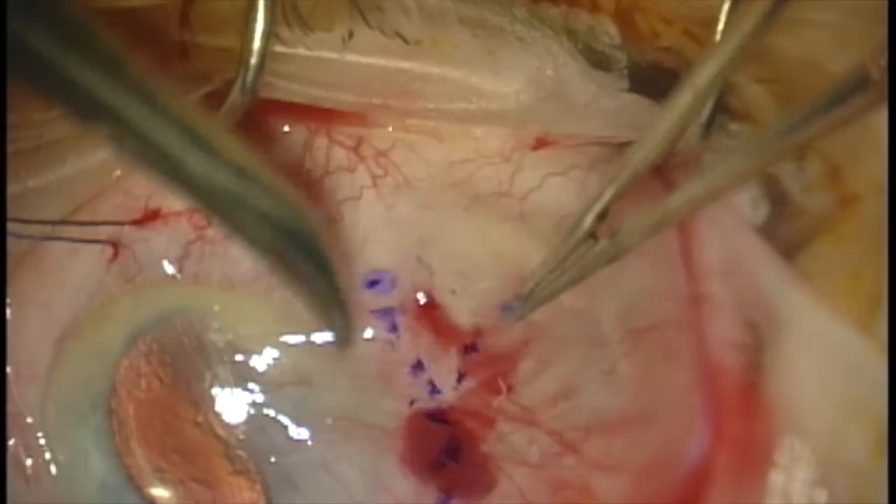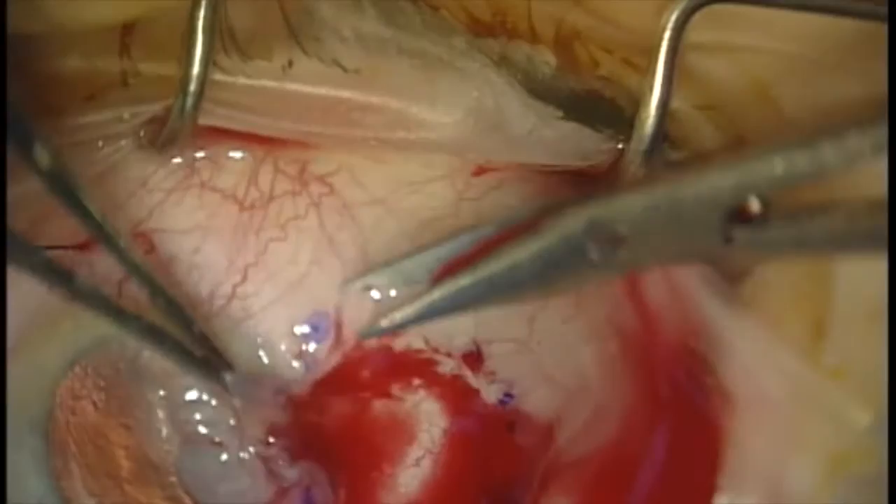One of our wonderful residents here is performing the dissection. You can see the conjunctiva is being dissected away from bare sclera towards the limbus.